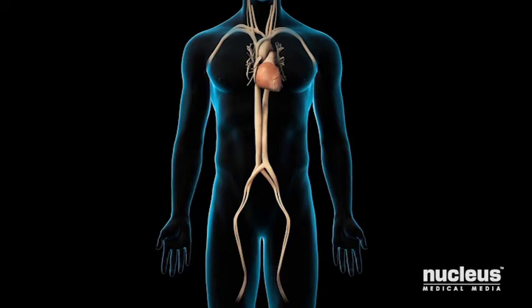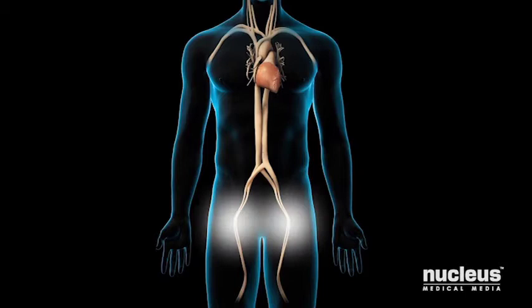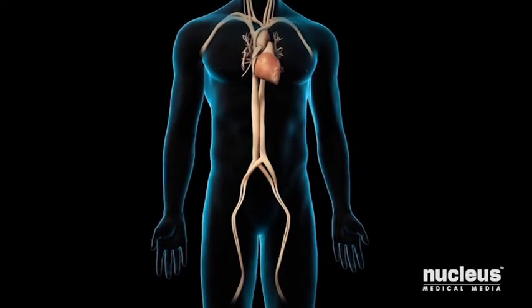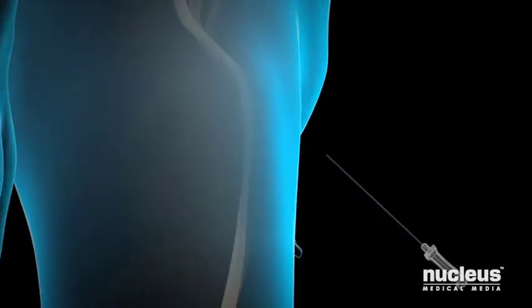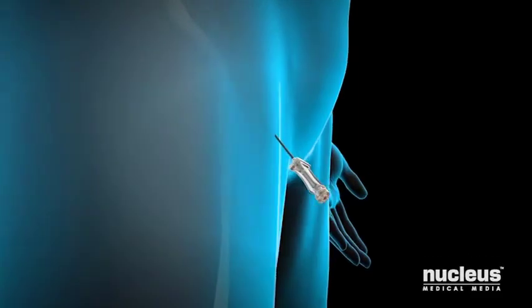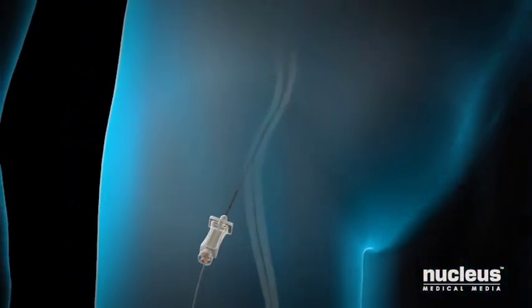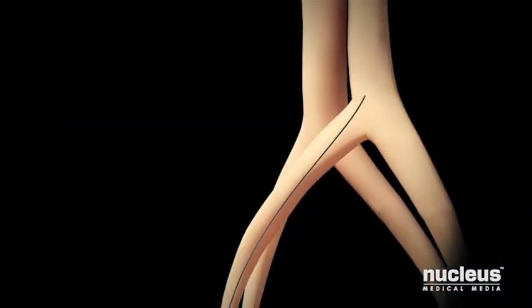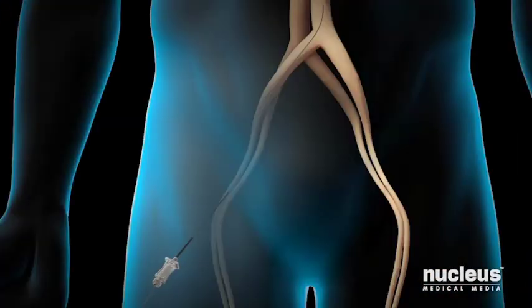Depending on whether the angioplasty is done through an arm or leg artery, the doctor will numb the skin in your groin or wrist area. Then a needle will be inserted through your skin and into your artery. Once the needle is placed, a flexible guide wire will be passed through the needle into your artery. The needle will be withdrawn and exchanged for a small flexible tube called a sheath, permitting access to your artery.